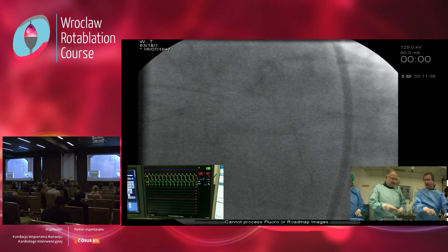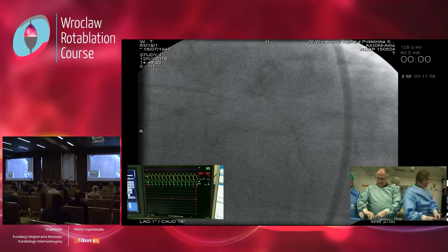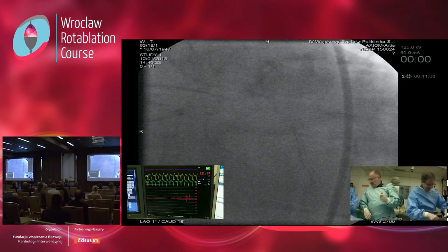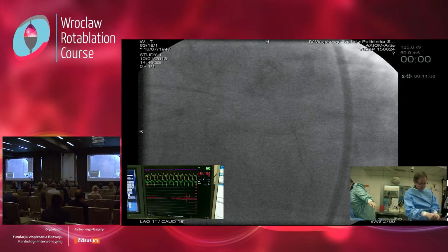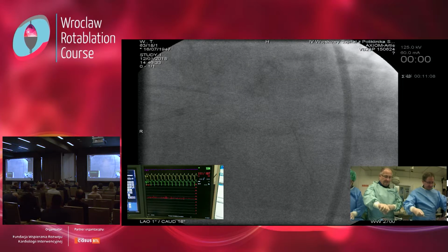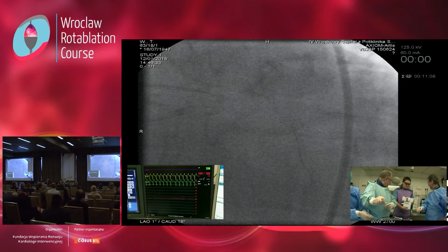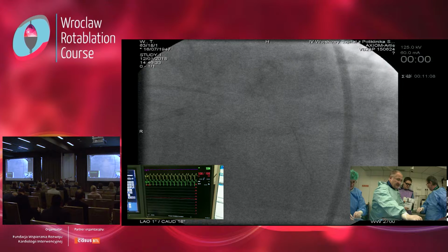Okay, and that's the time now to go with one more wire to the circ. So could I have Samurai? So what do you have? We need two stents. That's okay.